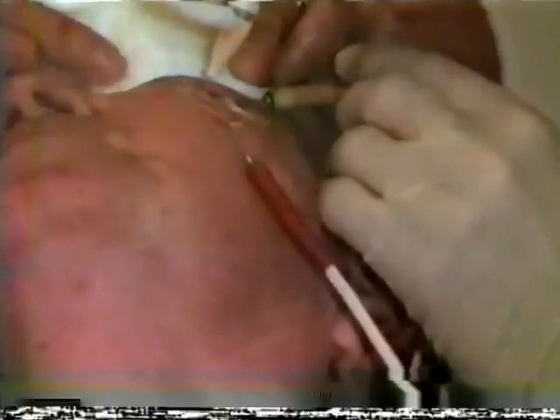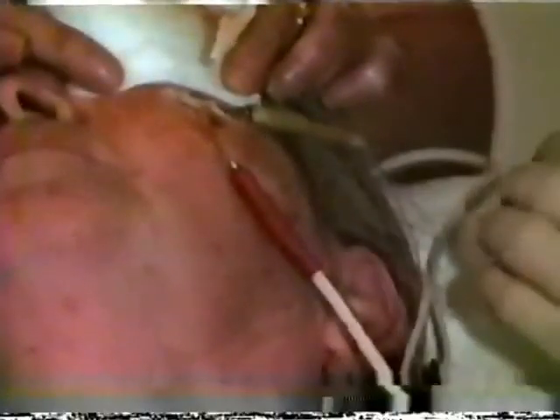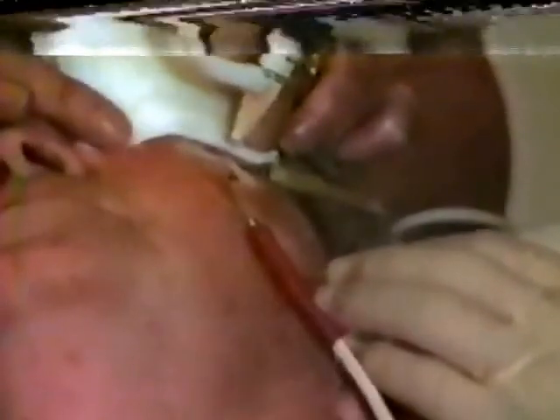We should make clear that liquid nitrogen is not a poisonous gas, that we're breathing nitrogen all the time. I think more than 80% of the atmosphere that we breathe is made up of nitrogen. All that we have here is liquid nitrogen, which is the nitrogen gas changed into a liquid, which lowers its temperature to 200 degrees below zero. Getting cold, Esther? Yeah, it comes down my neck all right afterwards. That dribbles, but that doesn't harm. It's just vaporizing. It's cold though.